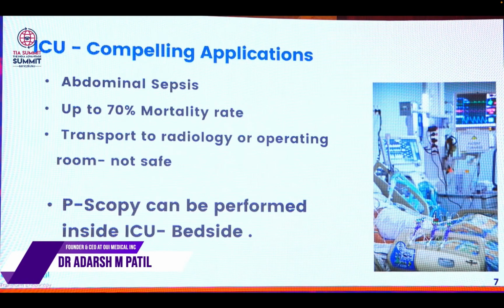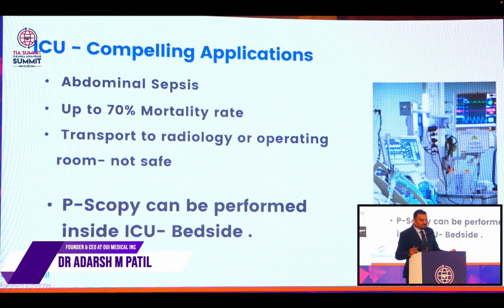So it has multiple compelling applications, one of them being patients admitted in ICU with abdominal sepsis. These patients have very high mortality rate because they are sick at presentation, they are on ventilator, dialysis. So transporting these patients to radiology or operating room is not safe. So in these patients, we can perform these scopies inside an ICU. We can go inside in the bedside, have a look and come to a definitive diagnosis.